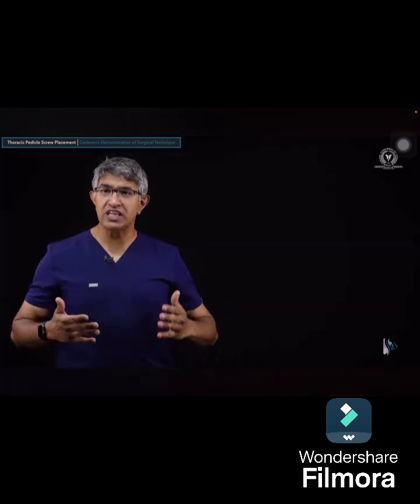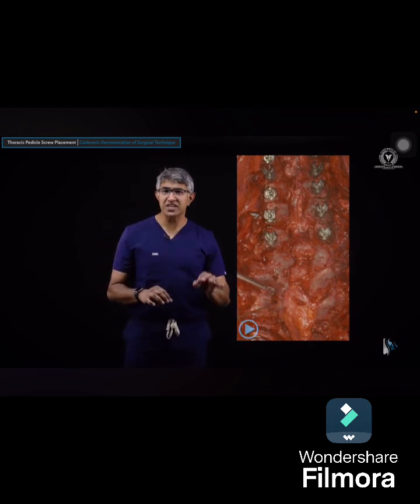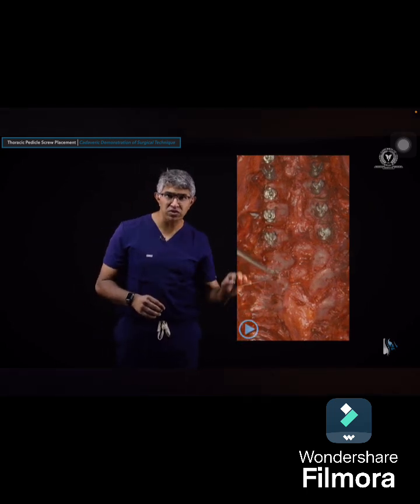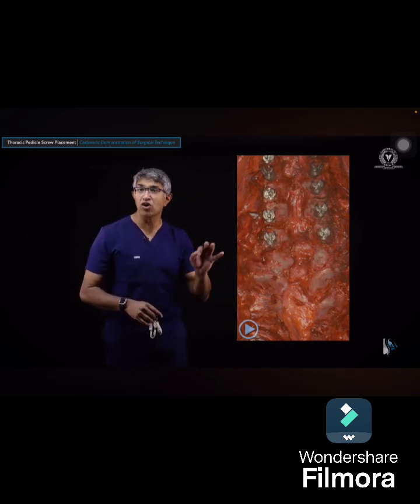So now, after using a gear shift to cannulate the pedicle, we typically will come in with a ball tip probe, and that is really to feel the margins. I tend to feel four walls and a floor, so that is rostral, caudal, medial, lateral, and then a floor. I'll check in this case both of them to make sure that I have all four walls and a floor.